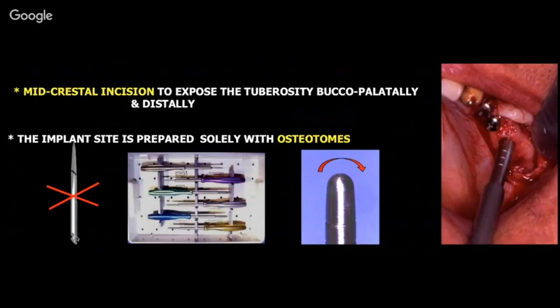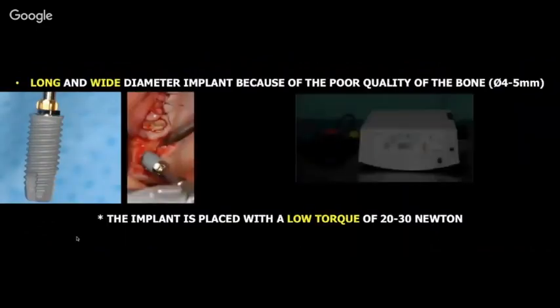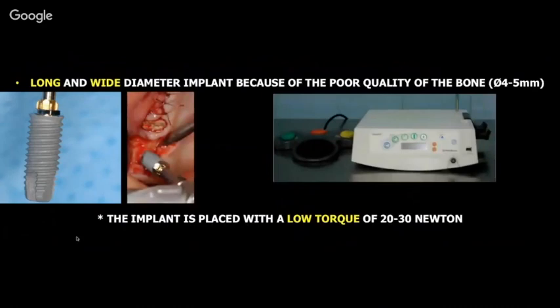These are the rounded ones, not the ones for internal sinus lifts. And you start with the 2 millimeter, 2.5, 3, 3.5, and you stop 1 millimeter less diameter than the implant used. Very important. We taught you, and we teach, that you put your implant at 45 to 50 Newton centimeter. But don't forget, this is in the good bone. When in external sinus lift, in internal sinus lift, whenever the bone is soft and you don't have a quantity of bone, you tell the nurse to lower the torque to 20 to 30 Newton. Why? I don't want my implant to go in quickly and be unstable. I want it to go in with difficulty.